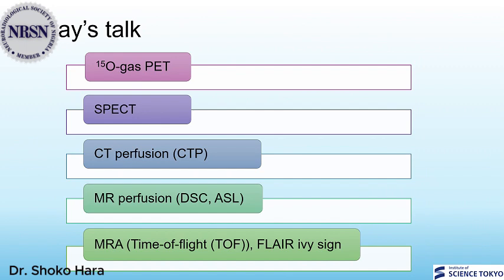Today, I will review the modalities used to evaluate hemodynamic impairment, highlighting their advantages, limitations, and clinical significance. I will begin with the older traditional modalities, then move to more recent advanced techniques, and conclude with alternatives to direct hemodynamic measurement.